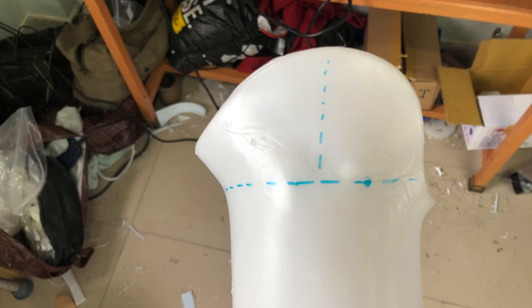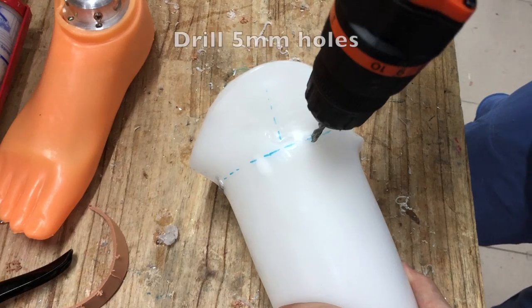With limb length corrected and the patient still comfortable, you can now attach the straps. The easiest way to make strap holes is to continue the patella bearing line to each side of the socket, then make a vertical line from the highest point of each wing down to the horizontal line, then make your holes 2 cm posterior to where both lines intersect.